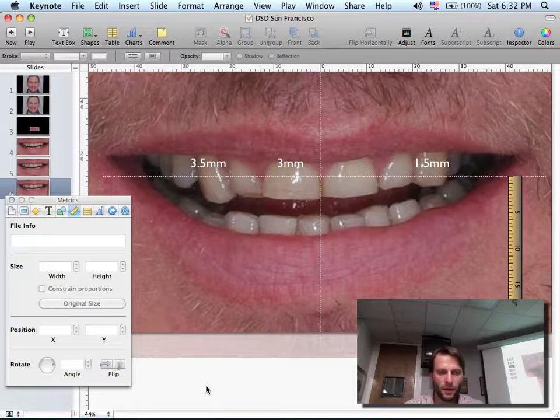Okay, that's it. That's the basic information. So the sequence that I usually do: if the dentist is sending me a face bow, I will mount the upper model with the face bow, then mount the lower against the upper. Then I will remove the upper model from the articulator, transfer these three measurements, mark the line, draw the cross, and wax up the buccal of the 6 anteriors, only guided by the photos, the video, and the cross. And then I will go back, place it on the articulator, and continue my functional wax up by waxing the lowers if needed, the posteriors if needed.